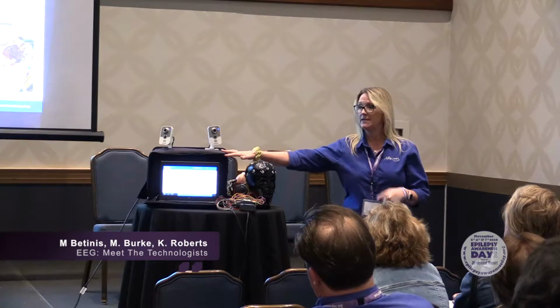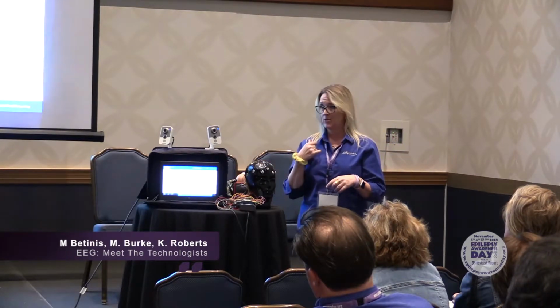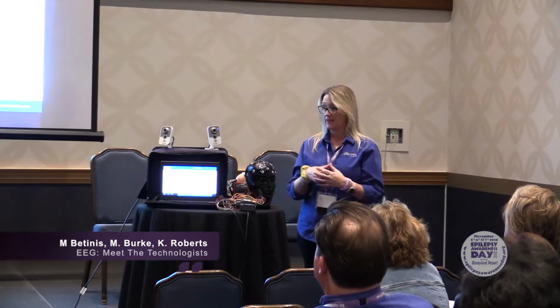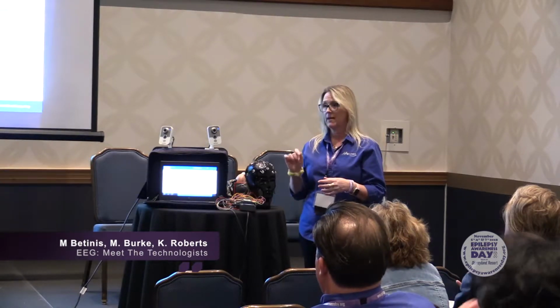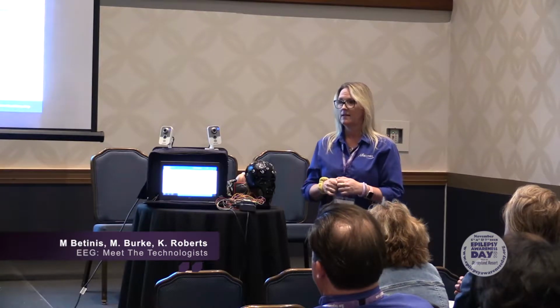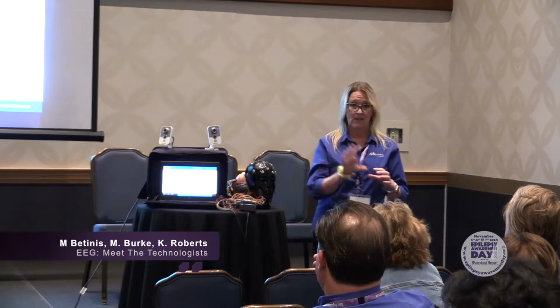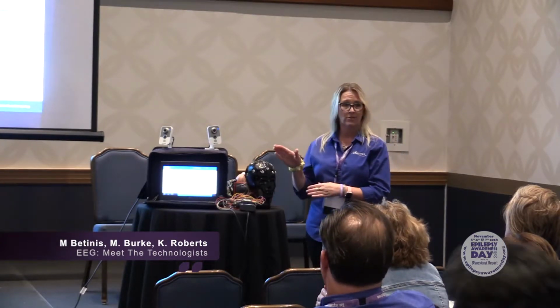All of this can also be sent to the cloud. So if you're at home and I'm your tech and you think your daughter's maybe having a seizure, you can push the button. You can call me. I can look at it. The neurologist can look at it. Yes, it was a seizure, or no, it wasn't. Or we can just check in from time to time, making sure all the electrodes are still attached.